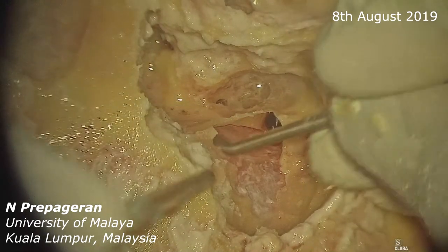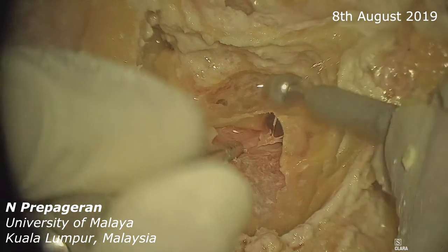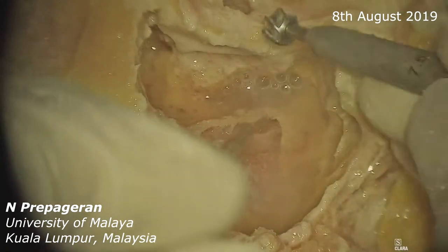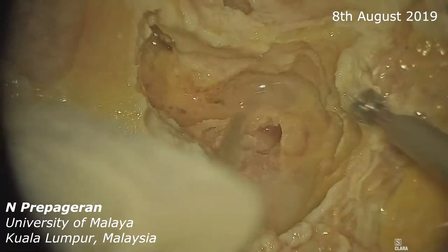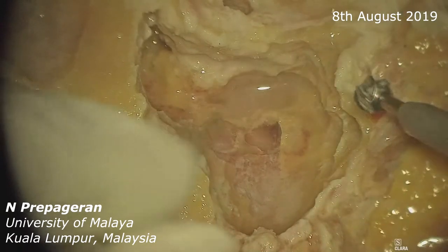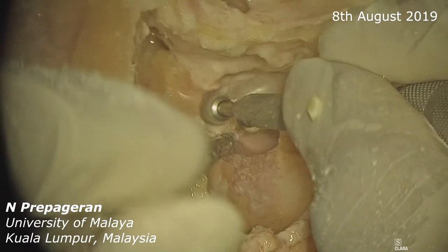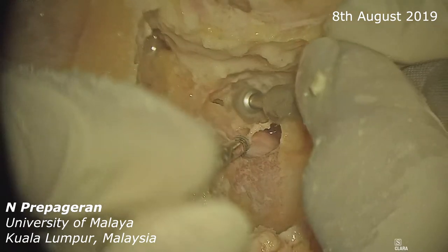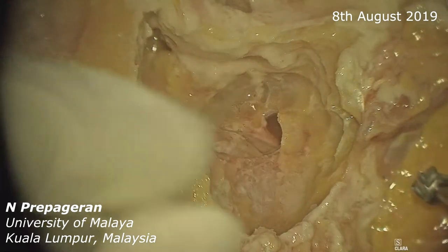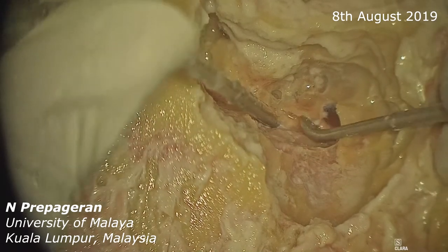So what we can do now is start drilling again. All we need to do is push down the sigmoid sinus and then drill away this ledge. This is the best way to do a pre-sigmoid — you basically identify the sigmoid sinus, push it down as you can see here, then drill like the way I'm doing. So now we're coming to the pre-sigmoid. Remember, I'm using the largest cutting drill that we have — when you do this, please use a diamond drill. We are doing this with the largest cutting drill just for speed.